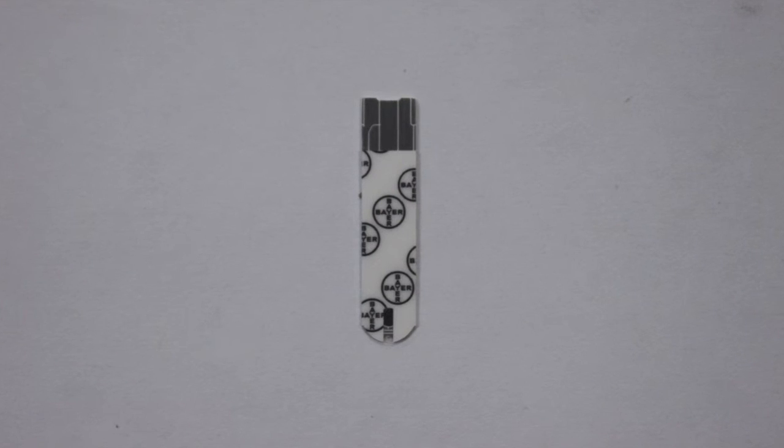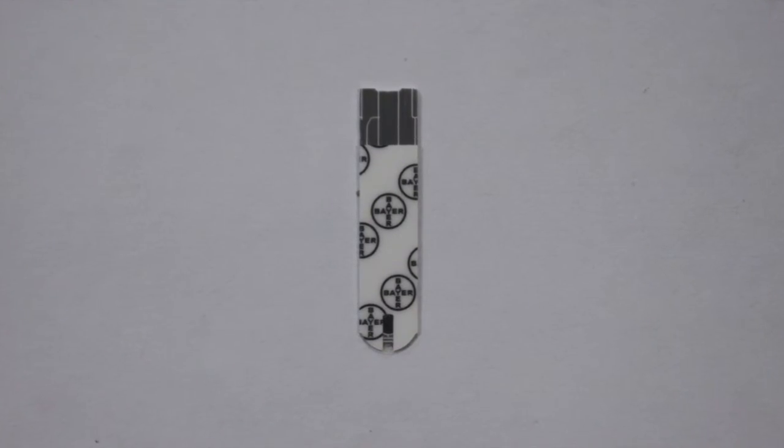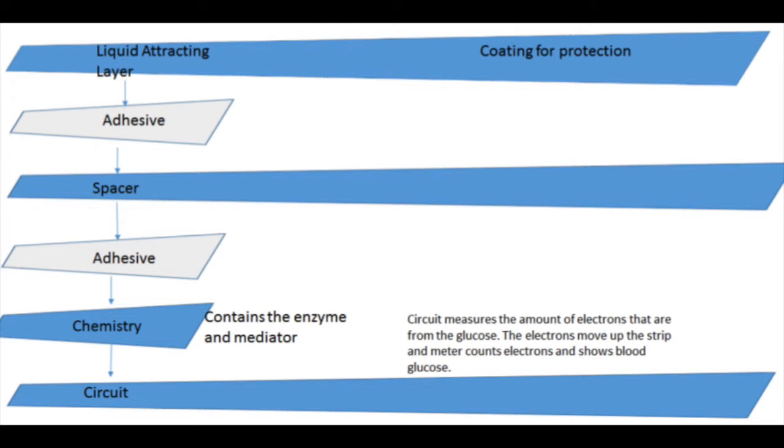This is what the test strip looks like. It is recommended to use the Bayer Contour Next brand specifically. The test strip includes six layers. The bottom layer is the circuit, which measures the amount of electrons from the glucose. The second layer is the chemistry layer, which contains the enzyme and the mediator. The third layer is adhesive. Then comes the spacer and another layer of adhesive. Next is the liquid-attracting layer, which attracts the blood from the user. Finally, there is a coating layer for protection from heat, water, or any other damage.